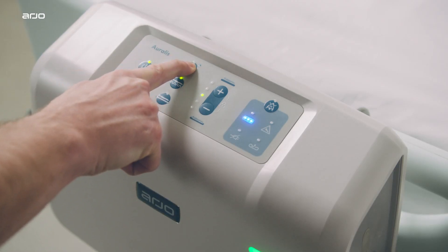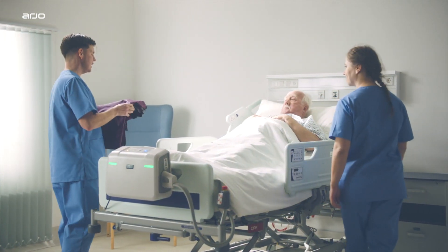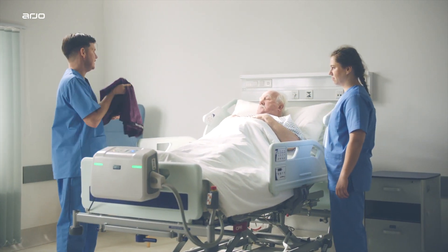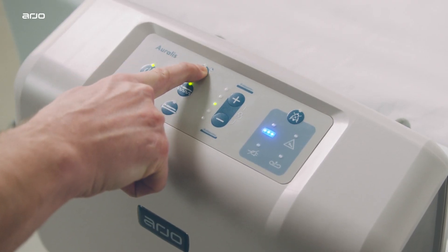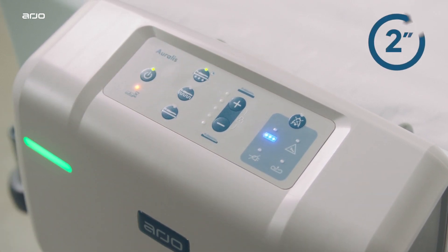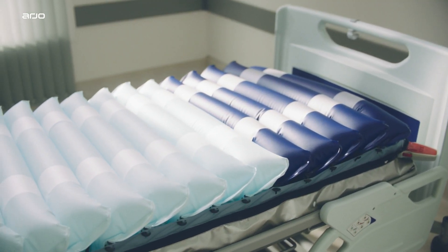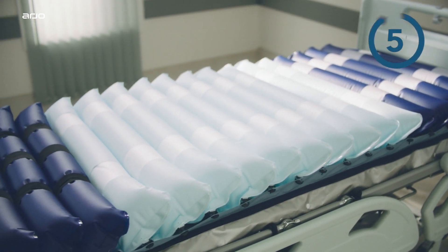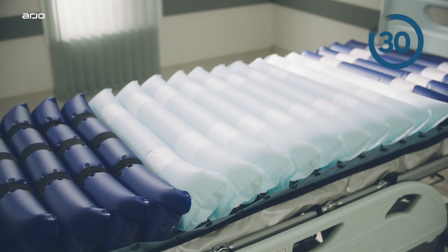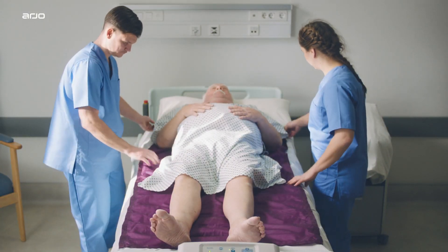AutoFirm mode. On the pump control, AutoFirm maximizes the air in the cells of the Oralis to provide a temporary stable surface to assist with patient transfer and other nursing procedures. To activate AutoFirm mode, hold the AutoFirm button down for two seconds. The mode remains in operation for 15 minutes, but can be increased in five-minute steps up to a maximum of 30 minutes. Note: the Oralis seat cushion does not have AutoFirm mode.